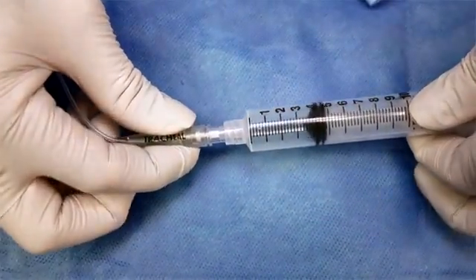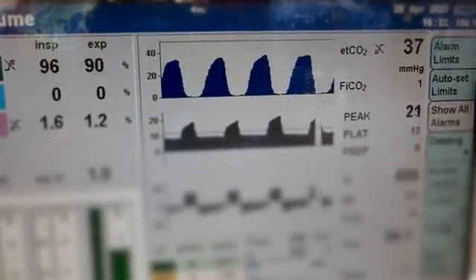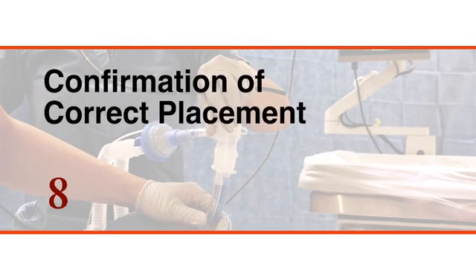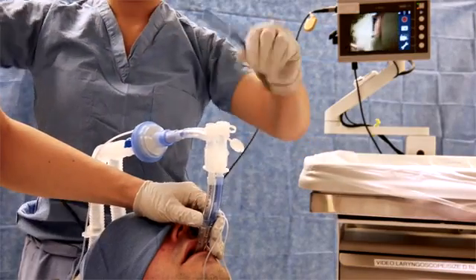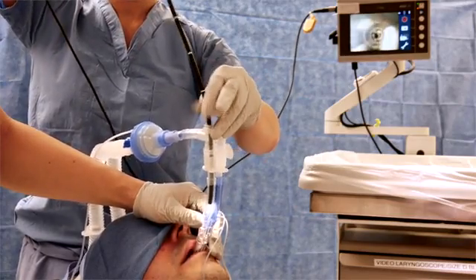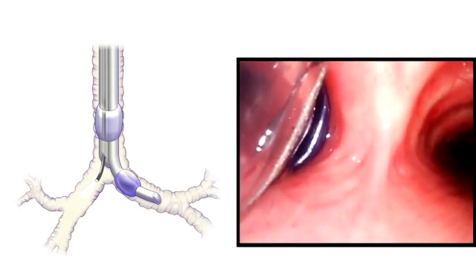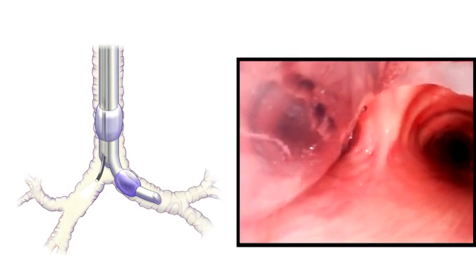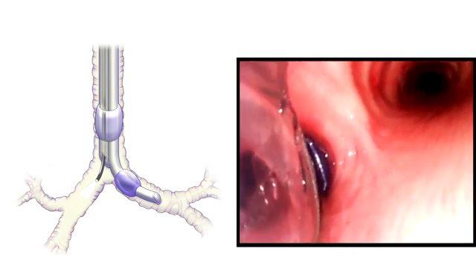Use the Y connector to connect the circuit to the double-lumen endotracheal tube. Inflate the tracheal cuff and establish ventilation. Monitor the patient for exhaled carbon dioxide. Perform fiber-optic bronchoscopy to confirm that the double-lumen endotracheal tube is positioned correctly. First, insert the bronchoscope into the tracheal lumen. Regardless of whether the tube has been placed on the left side or the right side, an inflated bronchial cuff, which is often blue, should be visible in the ipsilateral main bronchus with minimal herniation of the cuff into the trachea.